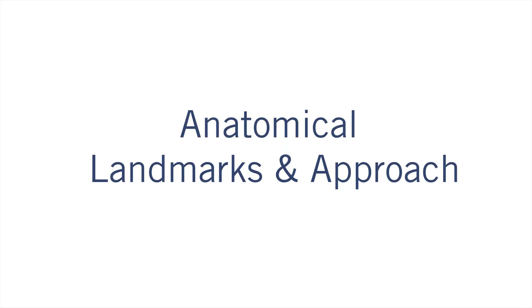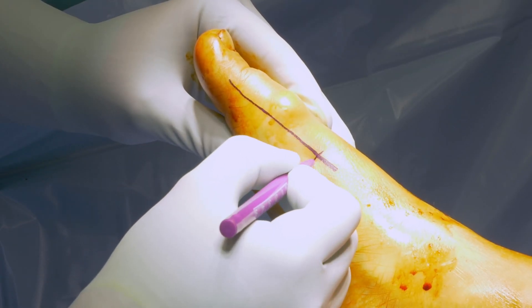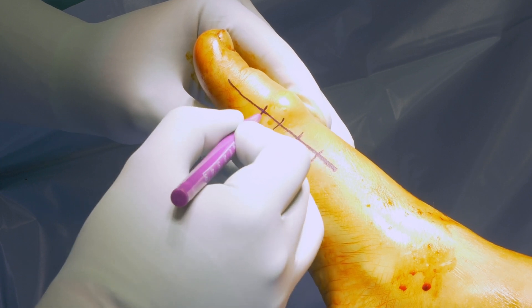Anatomical landmarks and approach: Start with a medial approach for good soft tissue coverage, as the plate will be placed on the dorsal side.